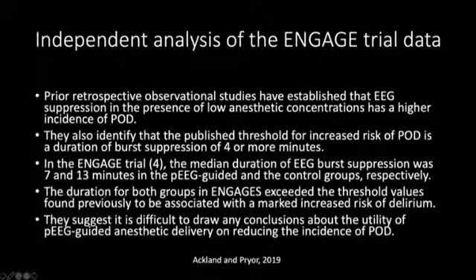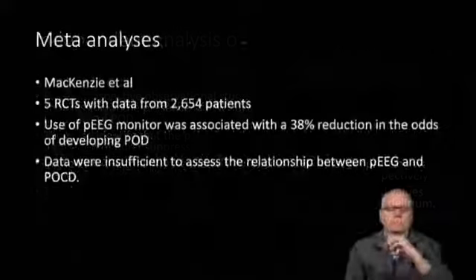They point out that the duration in both groups in ENGAGES exceeded the threshold values found previously to be associated with a marked increased risk of delirium. And they say it's difficult to draw any conclusions about the utility of processed EEG-guided anesthesia delivery on reducing the incidence of POD.